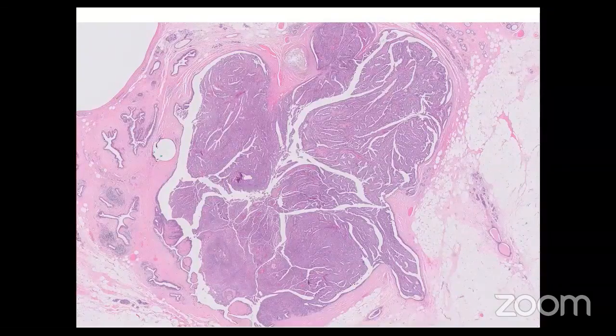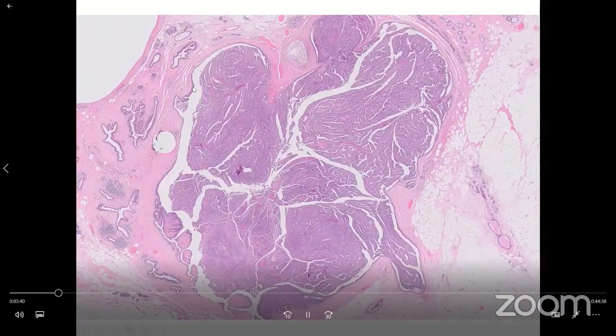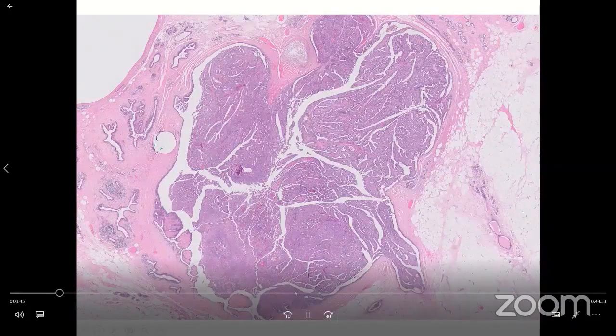Down the microscope at scanning magnification, the intraductal papilloma shows arborescent papillary fronds that extend into a distended duct space, and you can note the epithelial lining of the dilated duct and the papilloma, which is arising from the fibrous duct wall with fronded architecture and anastomosed papillary fronds.